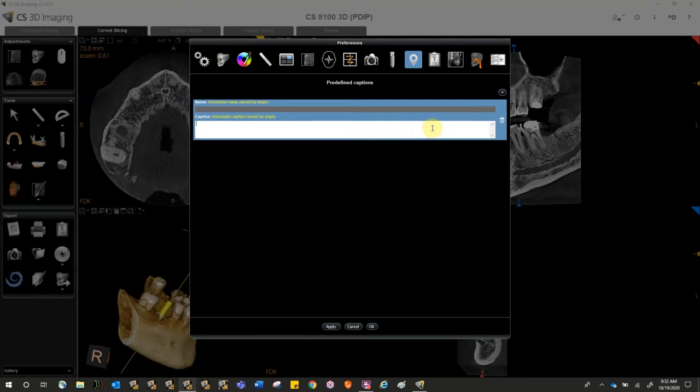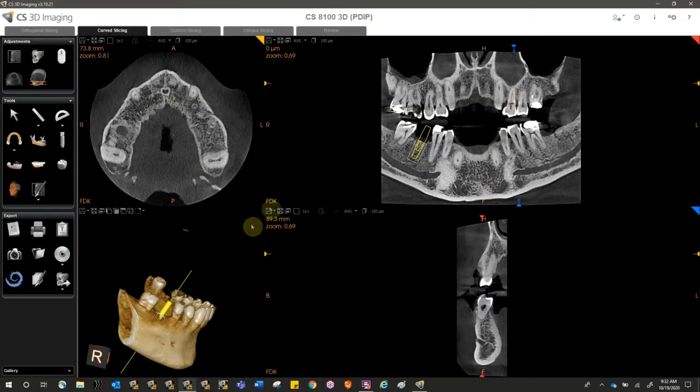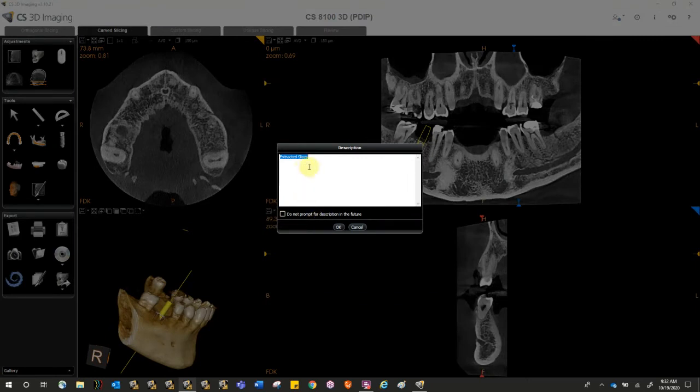And then we will come down here. You would have had your DICOM snapshot already. Then you could name this. And then this is going to save it. Then we're going to open up our gallery tab, make sure that it's there. We can double click it this way. And then this is going to launch us into our review tab.